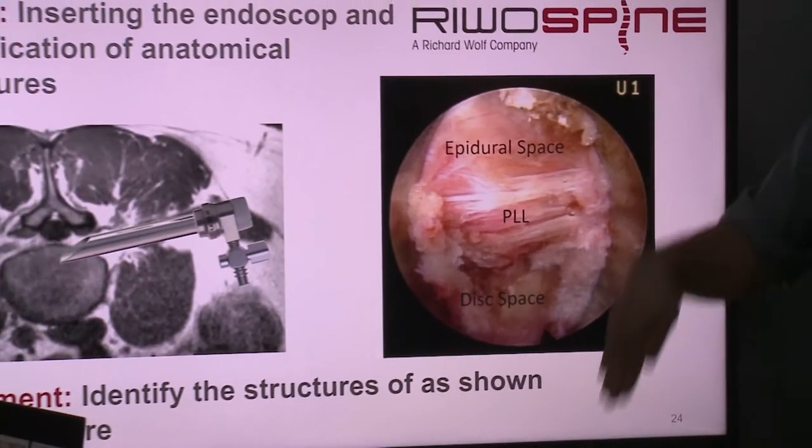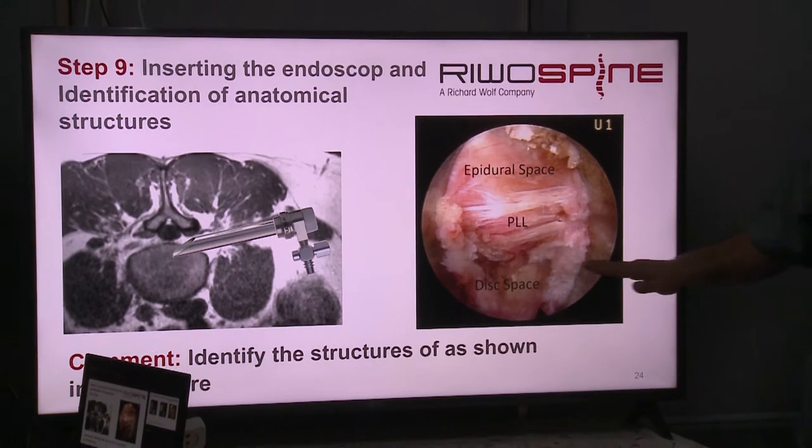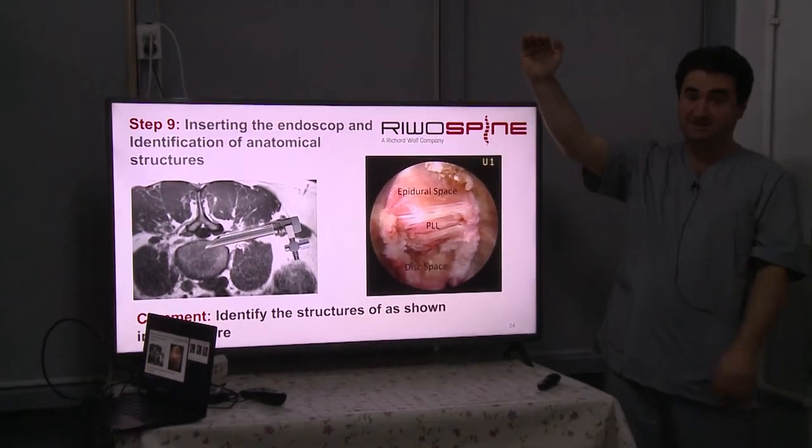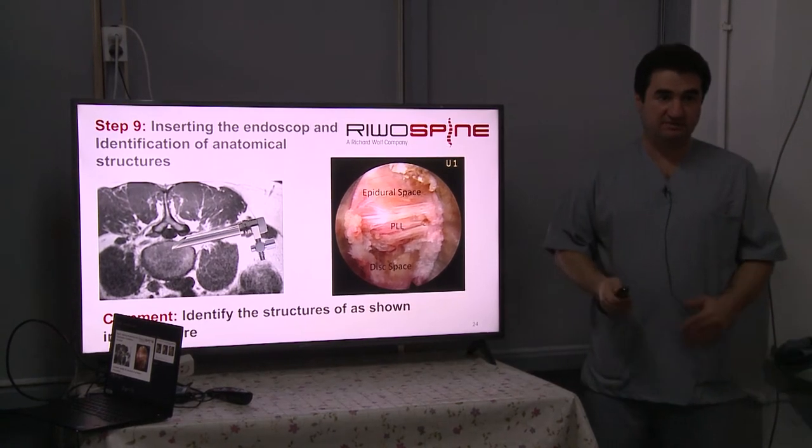The other one is posterolateral. You go inside the disc. We want to go epidural space because the herniation is there. Yeah? Is it clear? And can we proceed? Yeah.